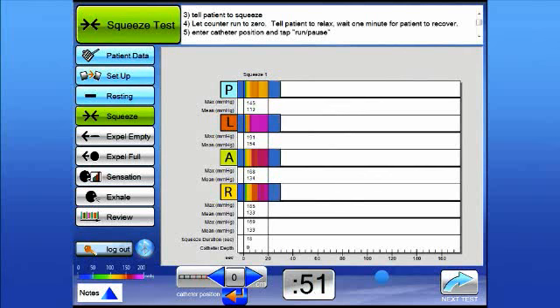If you choose to start another squeeze test prior to a 1-minute waiting period, the system requires at least 20 seconds before you can enter the catheter position to restart. You'll notice that when the counter is at 40 seconds, you'll be able to enter the catheter position, and then 5 seconds later, the initialization reading will appear to do the Run position again.